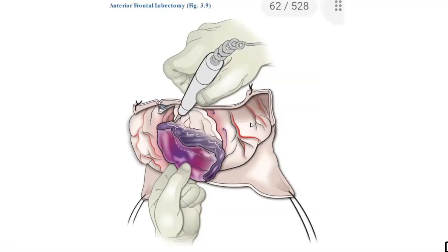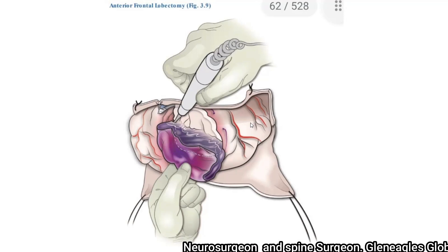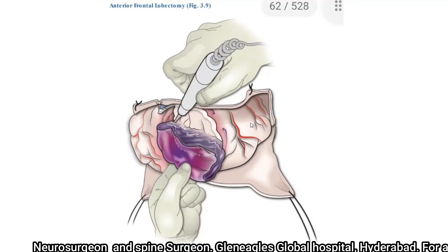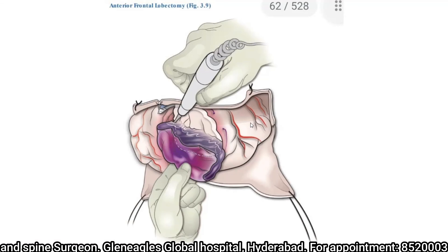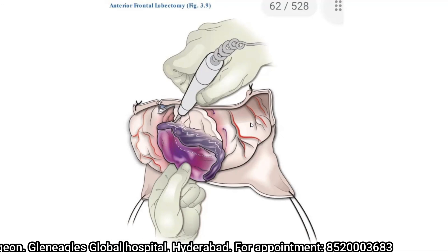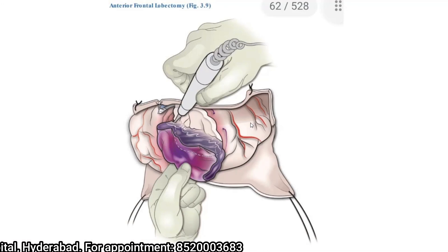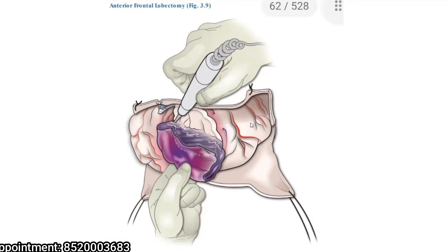Once hemostasis is achieved, the next steps are similar to the previous session. Decide whether to perform a primary duroplasty, an expansion duroplasty, or simple tack-up sutures with Gelfoam. Decide whether to replace the bone flap or preserve it elsewhere. Achieve hemostasis, place a closed suction drain, and close the skin in layers.